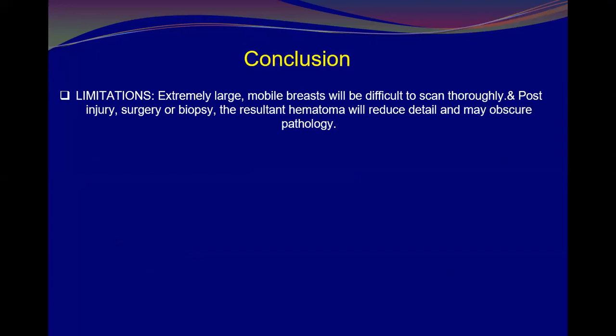And limitations of mobility and of a very large breast should be considered, and post-injury, surgery, biopsy, or resultant hematoma, all these can give limitations for ultrasound and obscure underlying pathology.